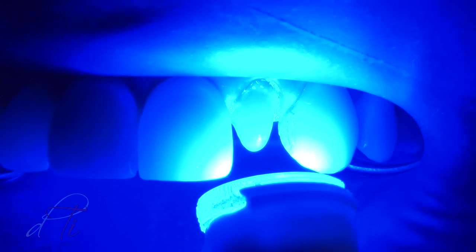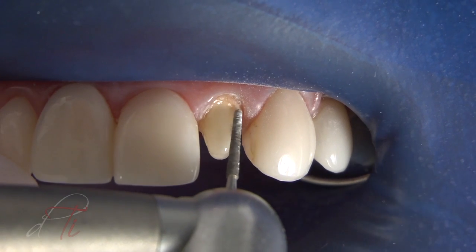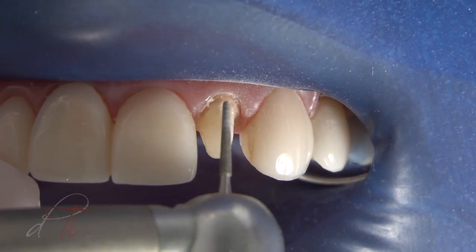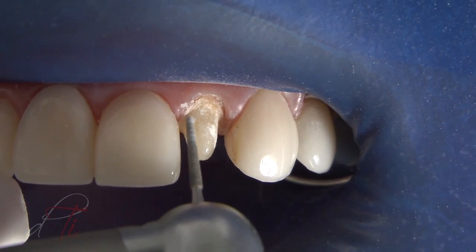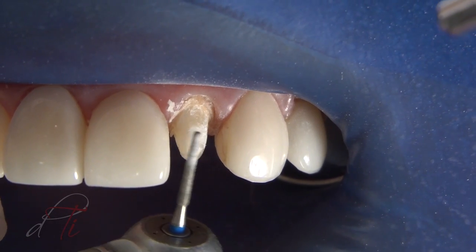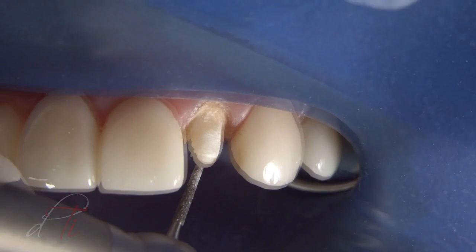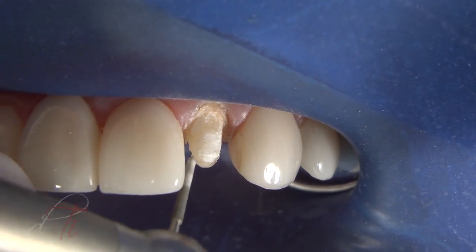Rebuilda DC is a dual-curing, radiopaque, fluoride-containing, flowable composite. The preparation is completed using a round-ended, tapered diamond burr — a 6850 by Brassler. The existing preparation was modified for an all-ceramic restoration with a circumferential chamfer margin. By achieving optimal geometric form during the sculpting stages, finishing of the composite is minimized, which can improve the physical and mechanical characteristics of the abutment.